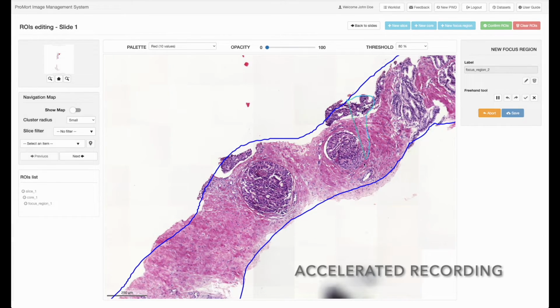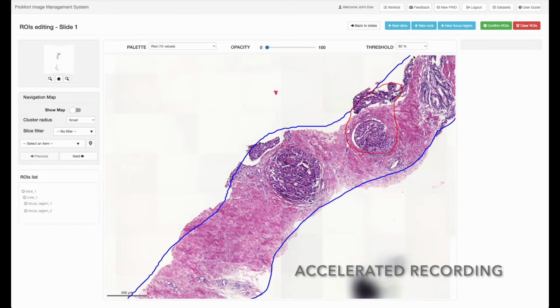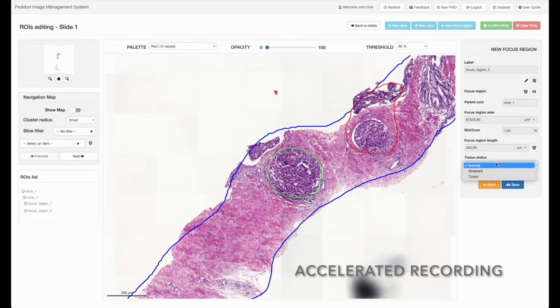Before DeepHealth, the annotation and examination process in the DP platform was completely manual. The DeepHealth toolkit has allowed us to add sophisticated AI-based functionality to assist pathologists in their work.